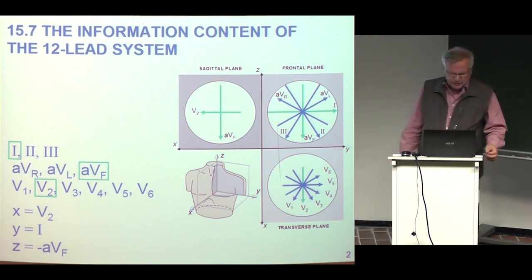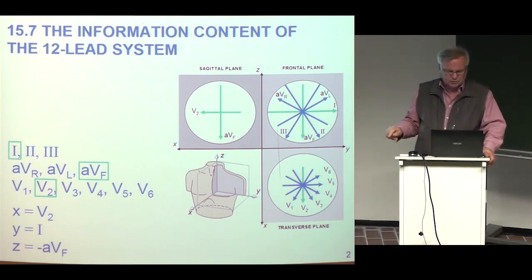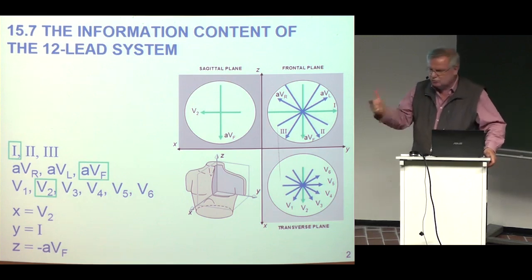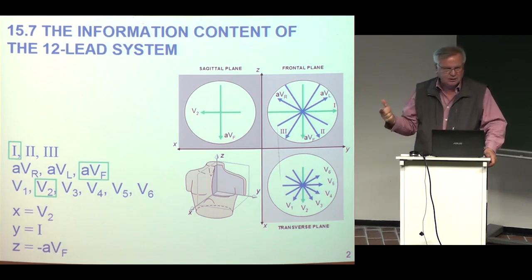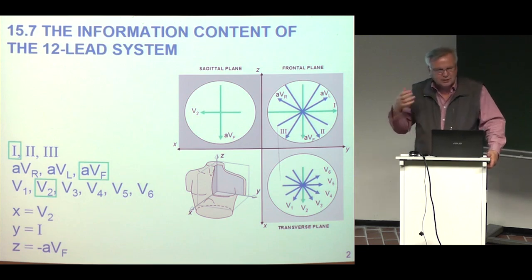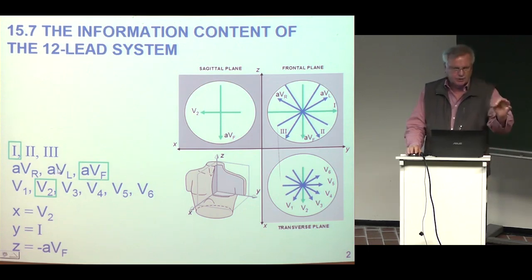The first six leads, 1, 2, 3, AVR, AVL, and AVF, are recorded from the same electrode positions. So I claim that if you give me any two of those recordings, I can easily calculate for you the four others with full accuracy. So there's redundancy. You don't gain anything from recording leads 2, 3, AVR and AVL if you record 1 and AVF. There's absolutely no new information.